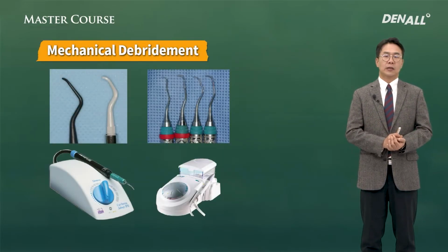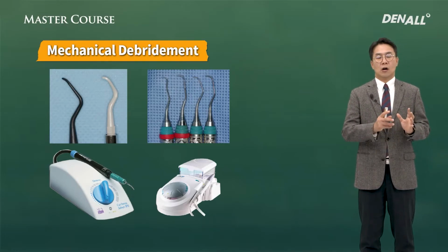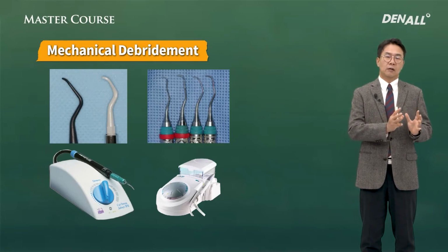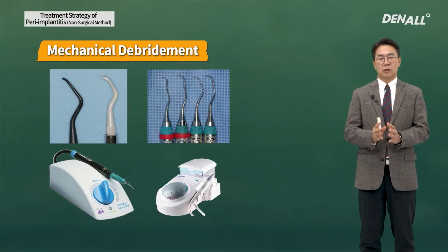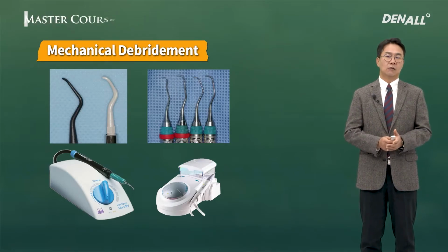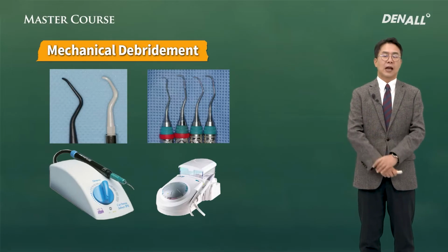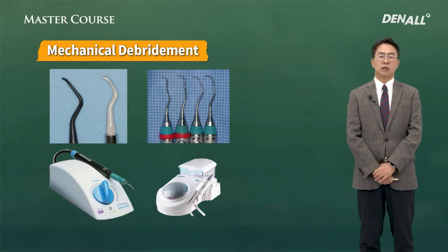let's look at mechanical cleansing. As shown on the top left side, if you use a physical scaler, you can use a plastic tip, or as shown on the right side, a metal tip. You can do it manually or use a machine as shown. There are so many options available and the results vary depending on the patient. Therefore, you need to be aware of the indications.